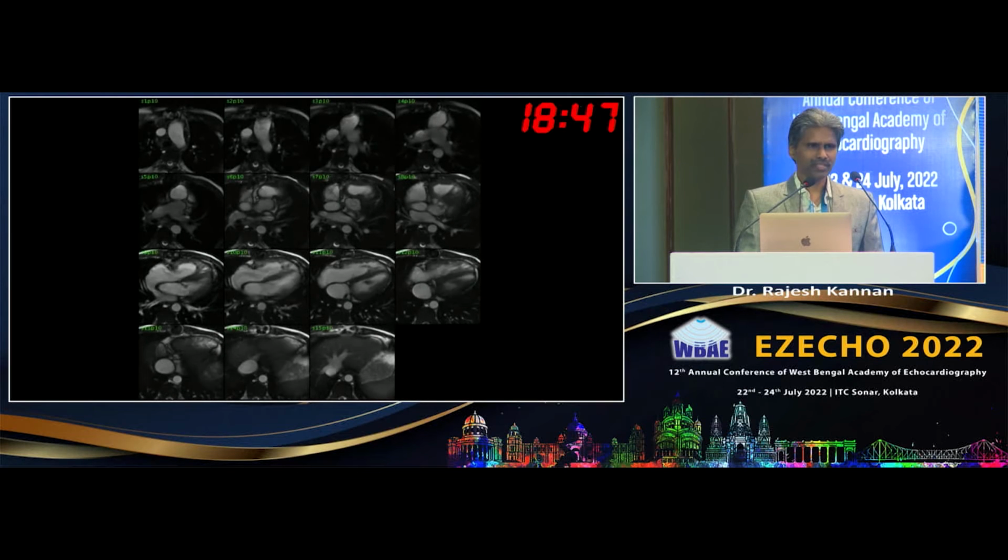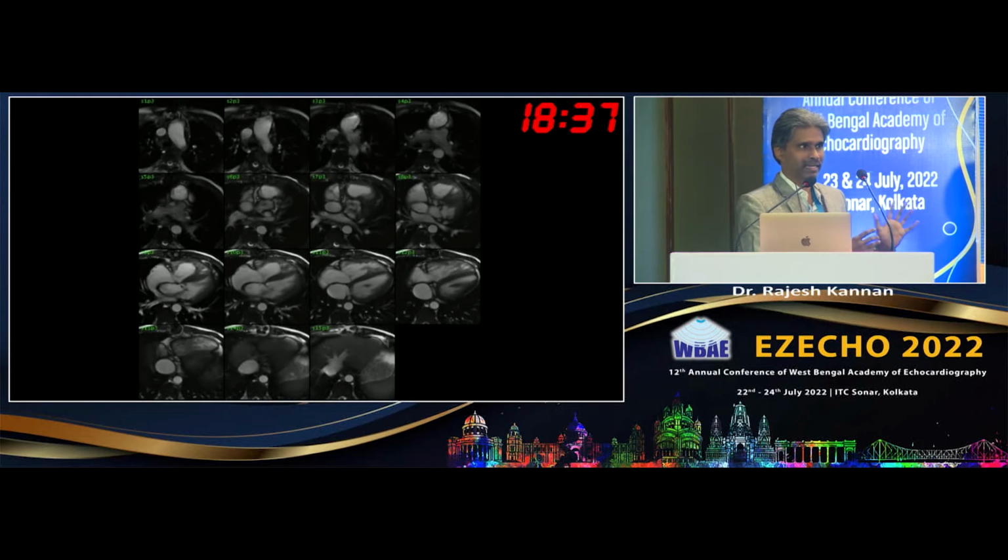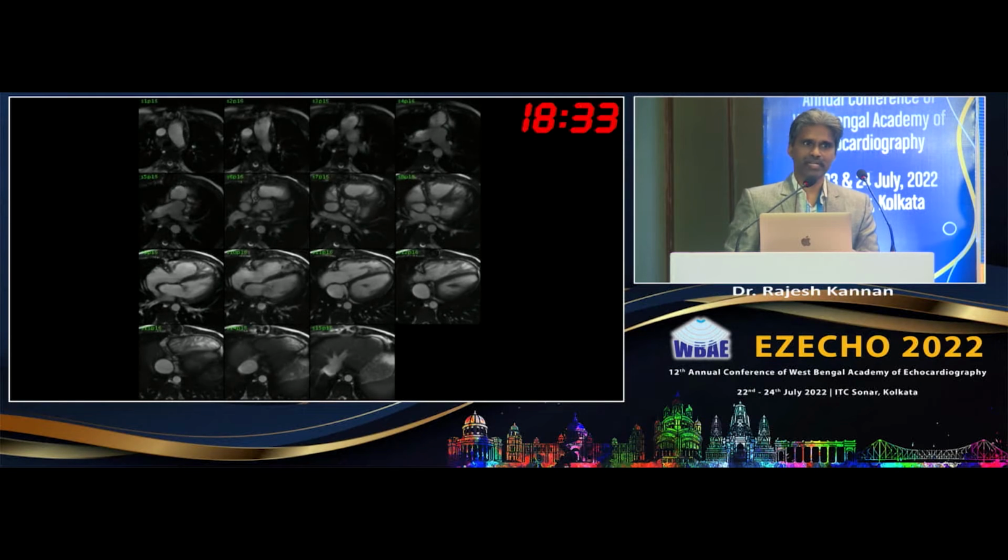Suppose you don't have a good technician to do the different cardiac views, where in complex diseases you can have dextrocardia, mesocardia, you can have different types of situs anomalies. Just by doing continuous cine sequences in all three planes, axial, coronal and sagittal, may be sufficient. You can still get a lot of information.